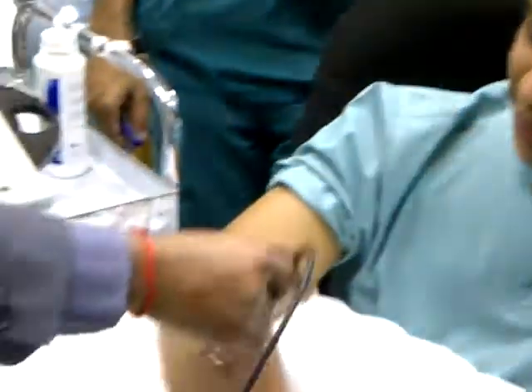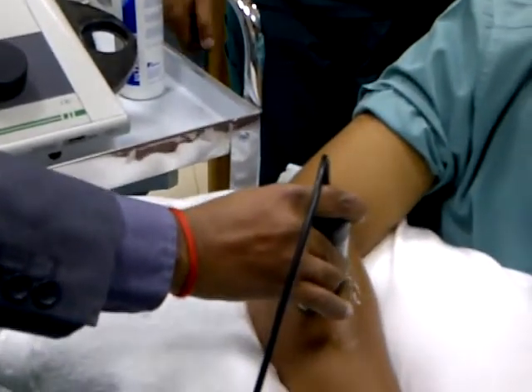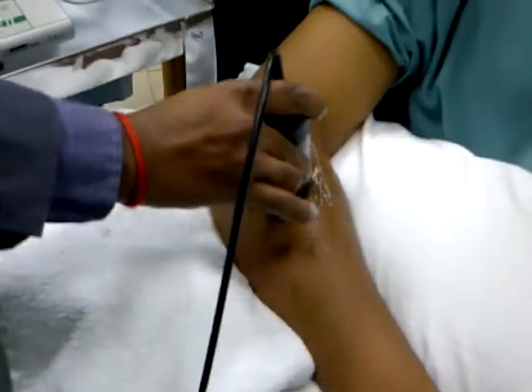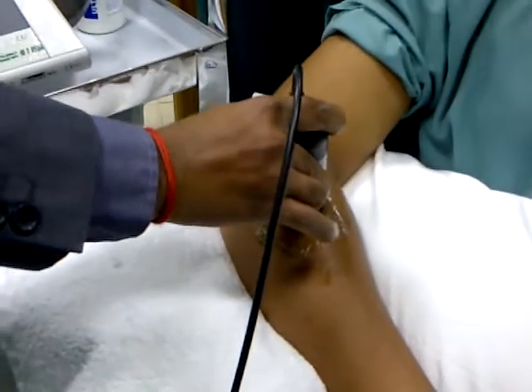Now he will not feel anything because it is pulse mode. Again, the duty cycle is very low. So he will not feel anything, or he may feel very little heat. And you are going to treat only 10 minutes, and the energy or percentage is less.